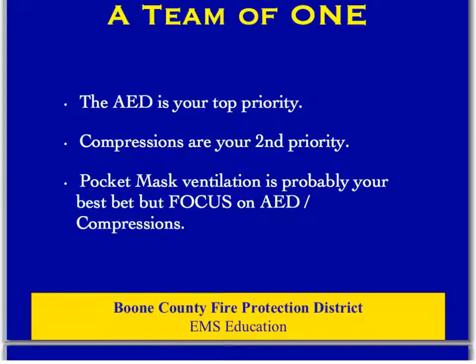And then compressions are your second priority. You'll see in a minute that when there's two of you there, right off the bat, one of you starts compressions while the other applies the AED. But if you're by yourself and you have to make the choice, then apply that AED as your top priority and be ready to start compressions. Ventilation is important, but it's not more important than compressions. And compressions in this case are not more important than an attempt to defibrillate. So you're going to put them in that order.